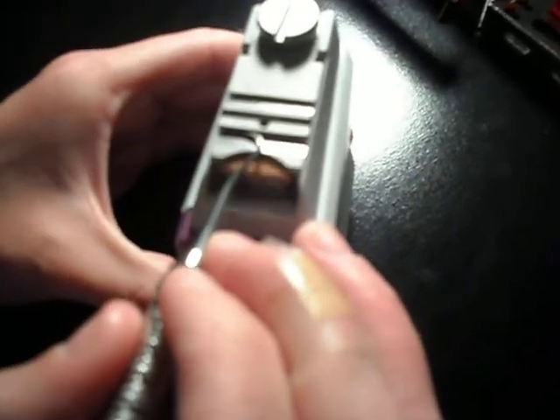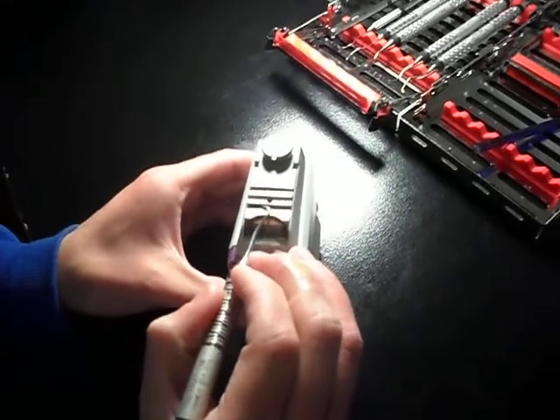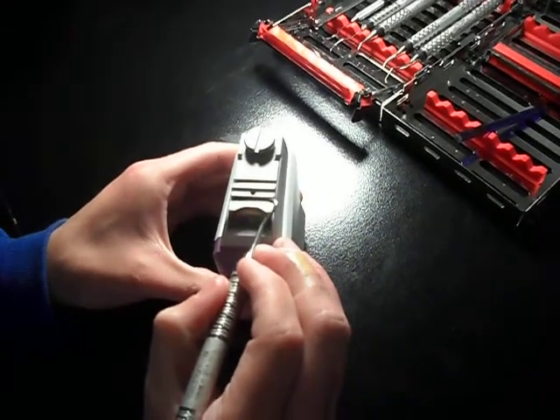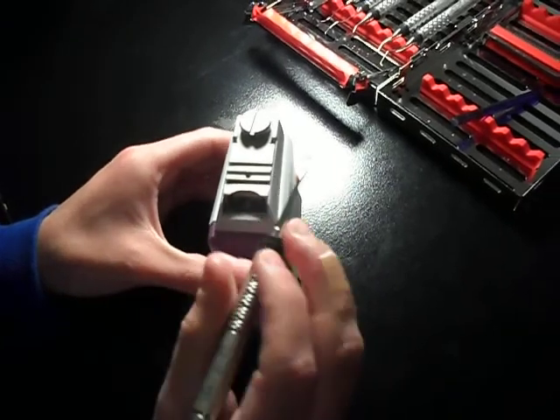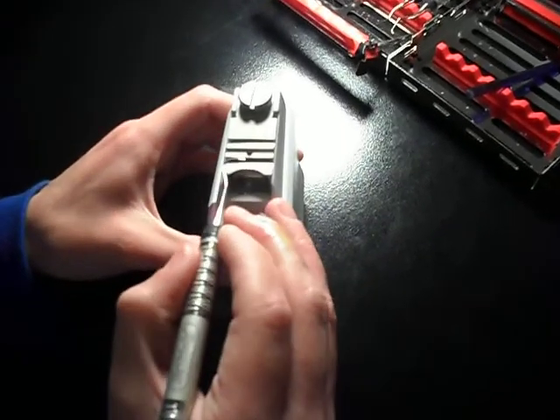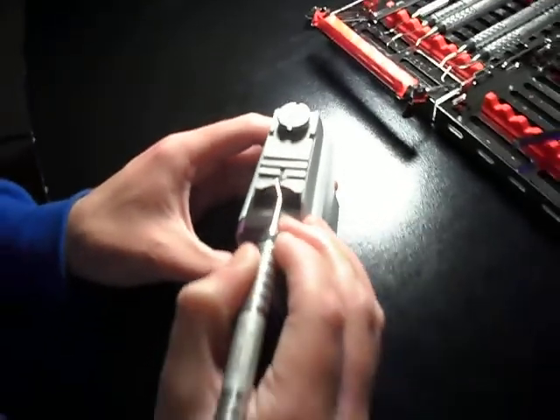And we're just going to move the blade back and forth along the stone 2 or 3 times. Doesn't take much. Okay, and then we're going to turn it over and do the other side. And you don't want to use a lot of pressure against the stone because you'll wear out the motor eventually, and it's not going to work.